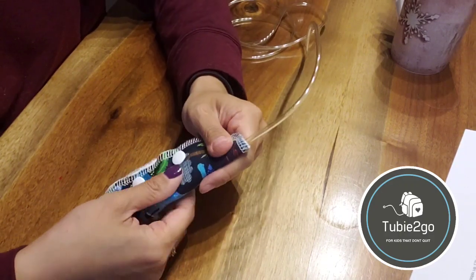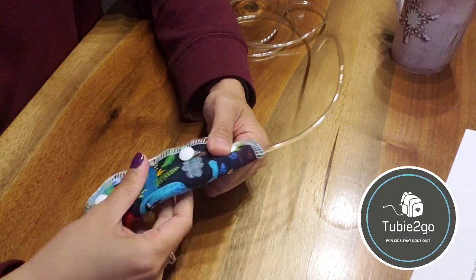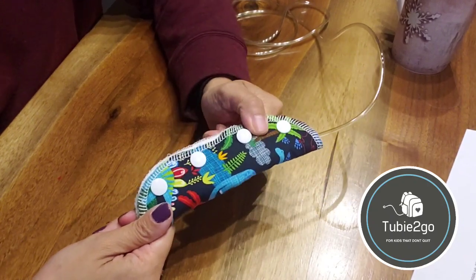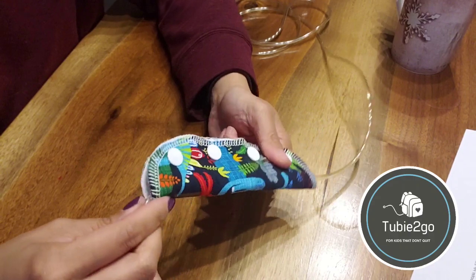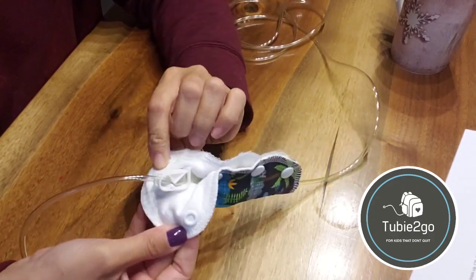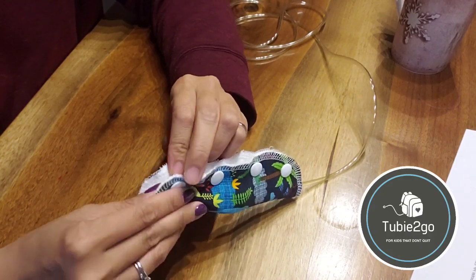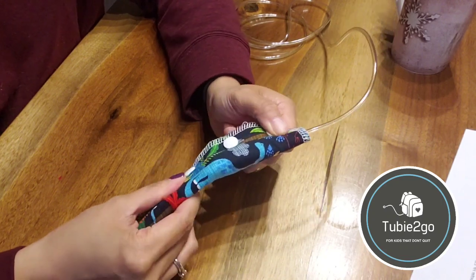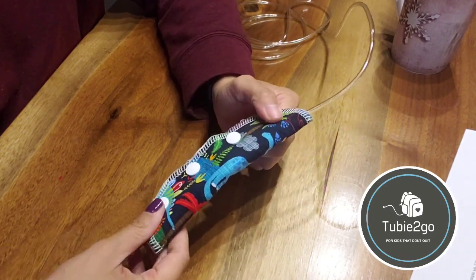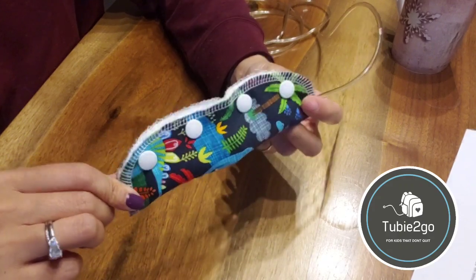Again, as I mentioned, it's really to just conceal the parts from curious hands. And so hopefully they don't have the dexterity or the fine motor skills to undo the snaps the same way that they might have the ability to just undo the ports, especially if you want to keep the clamp inside the port cover as well, then that's another source of feeding the bed. They're available on Etsy, on Facebook groups, on Amazon. If you look up G-tube port covers, any of those search terms, you should be able to find something similar to this.